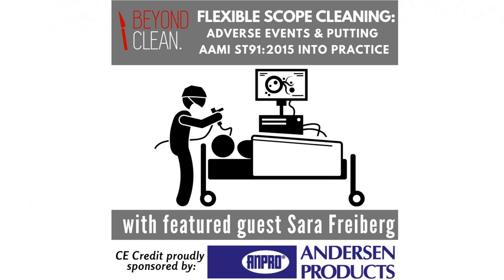I would say some common root causes for inadequate manual cleaning entail items such as inadequate or no current training protocol. Oftentimes I go into facilities and they weren't professionally trained or properly trained on the current manufacturer's instructions for use based upon their scopes.